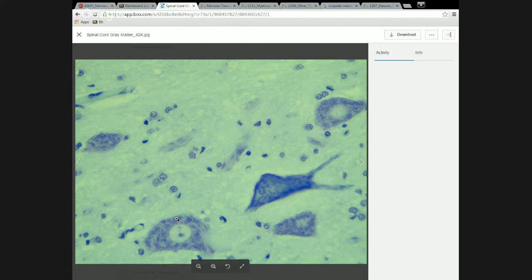The Nissl stain, the reason we can see that cytoplasm so clearly is because it's staining those ribosomes. And the sort of texture, pattern, whatever we want to call it, of this cytoplasm is really showing you where there's higher concentrations of ribosomes and the lighter spots are where there aren't a lot of ribosomes. Okay. So to some extent, what we see in that Nissl stain is sort of a picture of where the rough ER is.